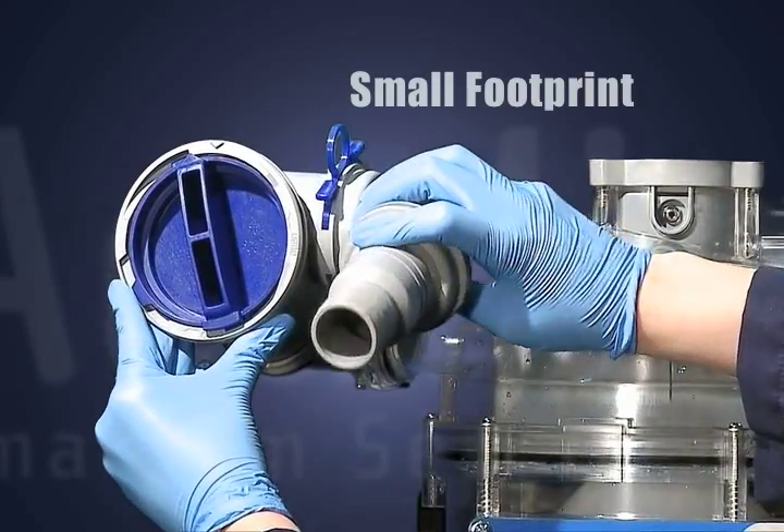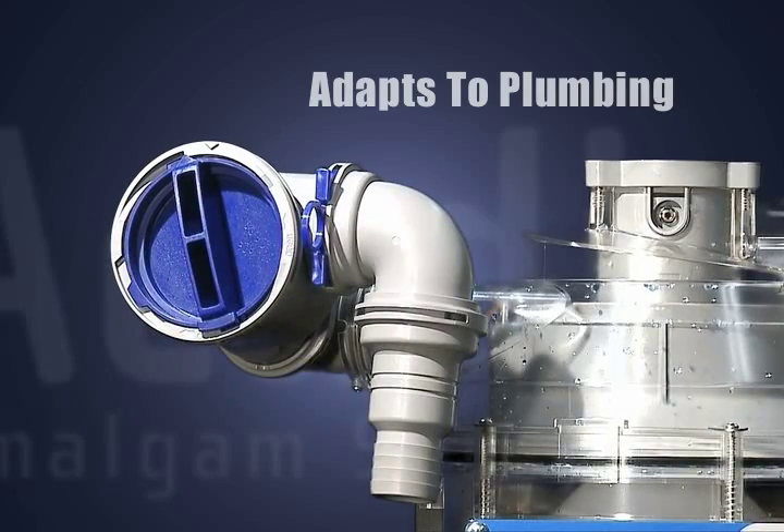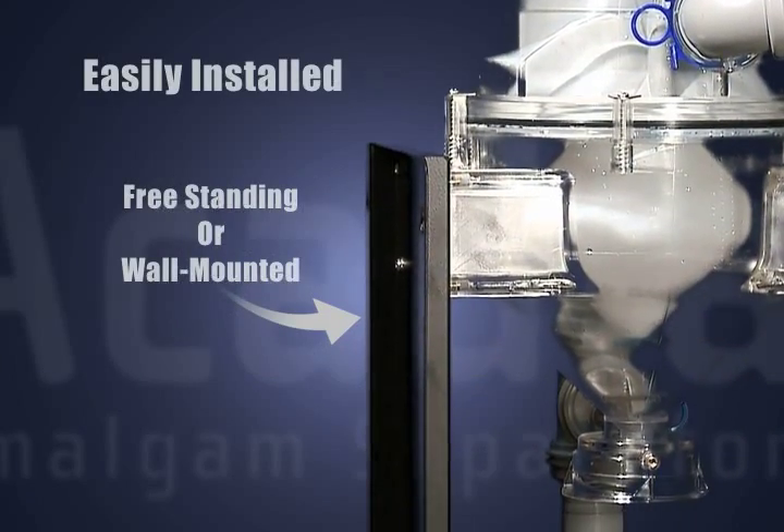Acadia has a small footprint. It's easy to install regardless of space or plumbing configurations. Install freestanding or wall-mounted.